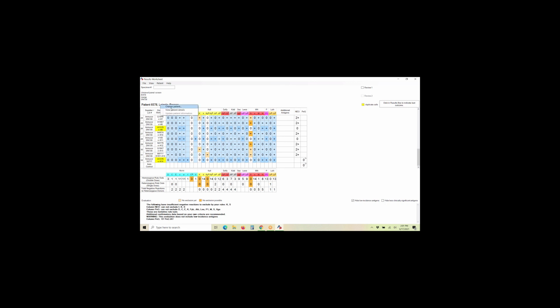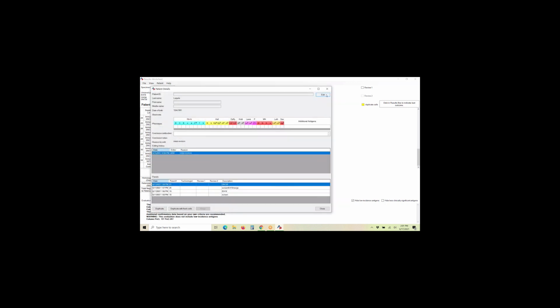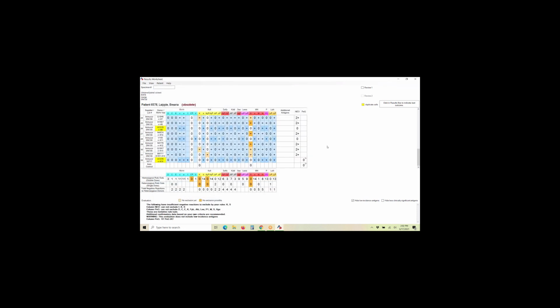So again, we're going to go to our patient. We're going to view patient details. We're going to edit K and S antigen type. Save it. Close it. Update. Save panel.